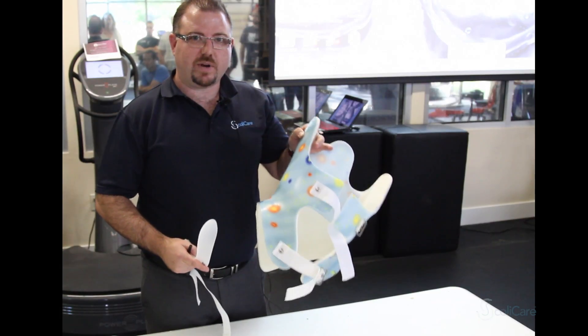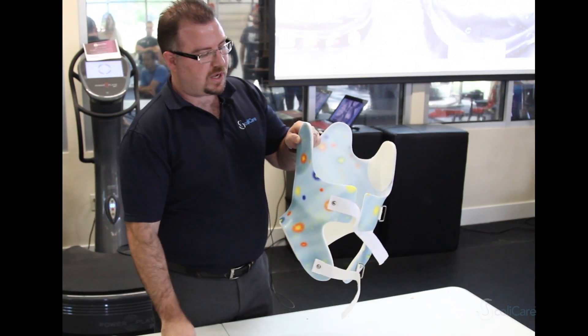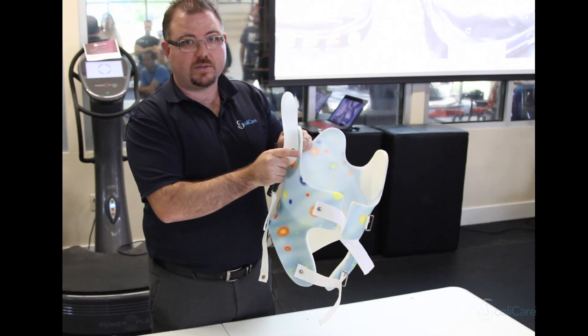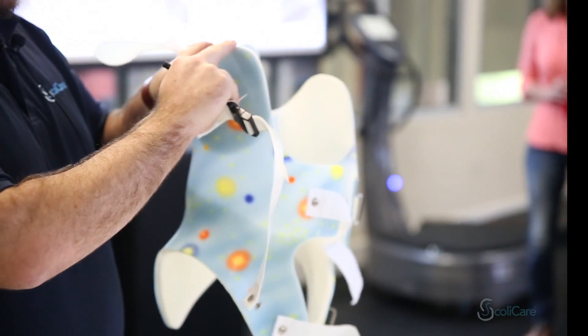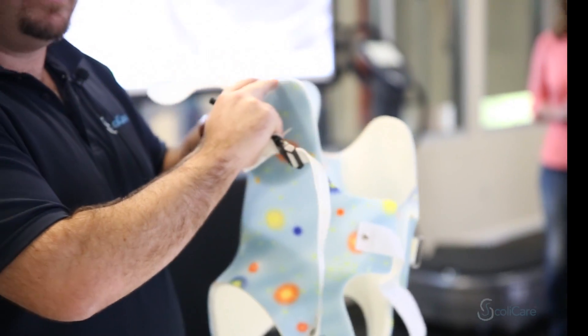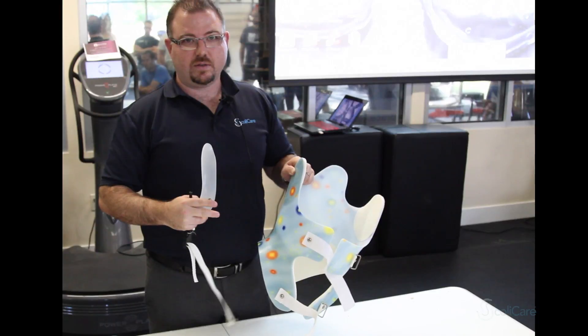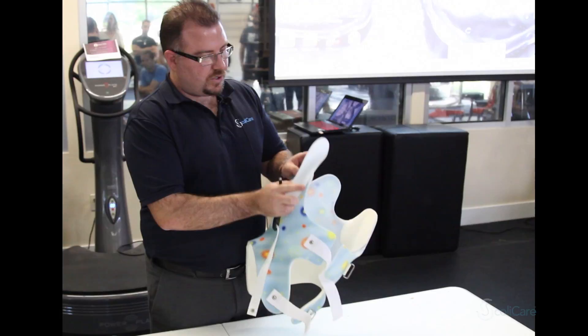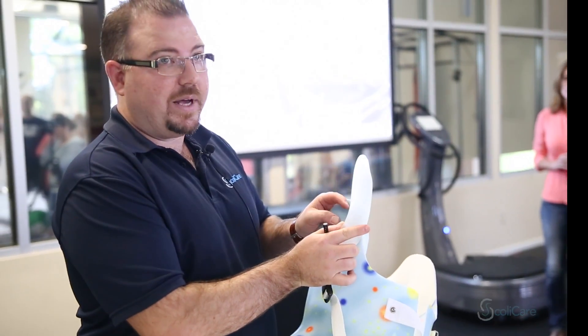Firstly, you would have fitted the brace around the patient to decide the level at which the arm is going to connect into the brace. Remember that this part of the brace under the axilla should be lower than the patient's axilla so that their arms can relax, and then this top part of the kyphosis arm will sit just below the clavicle of the patient.